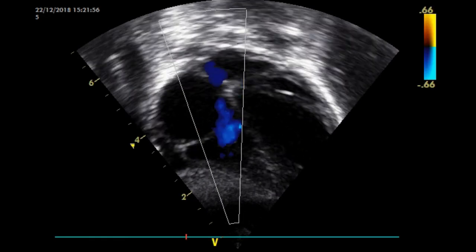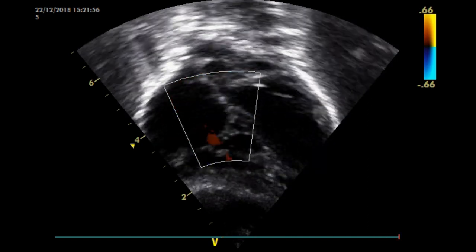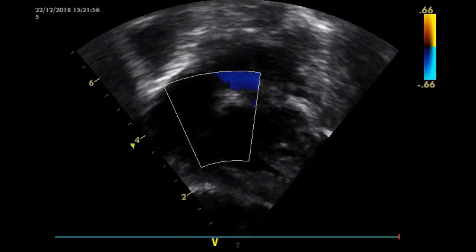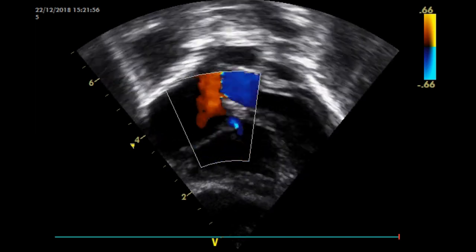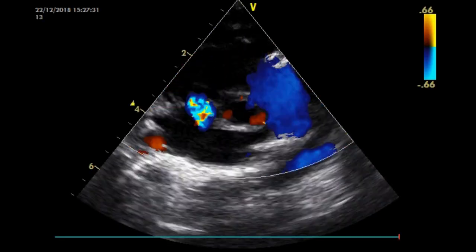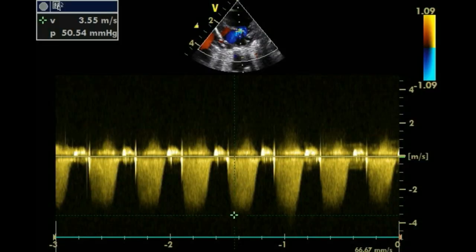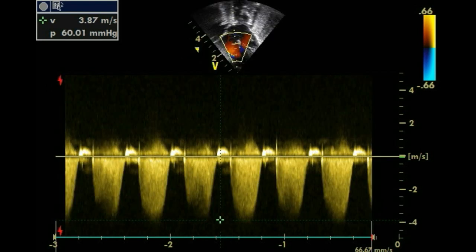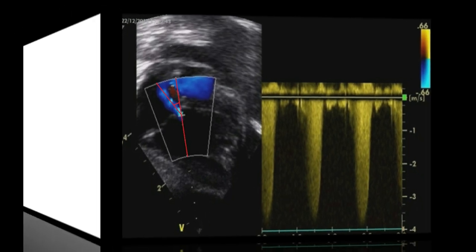An optimal quality tricuspid regurgitation jet shows a well-demarcated envelope. This is aided by assessing maximal tricuspid regurgitation jet velocity from three views: apical four-chamber, short axis, and modified parasternal long axis. Measuring an inadequate Doppler spectral envelope may lead to underestimation of systolic pulmonary arterial pressure. The angle of insonation should be less than 20 degrees to achieve a reliable measurement.